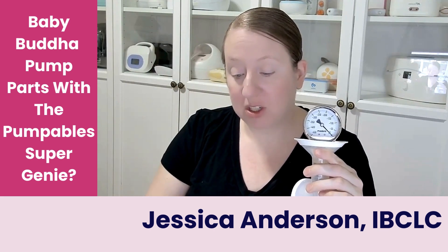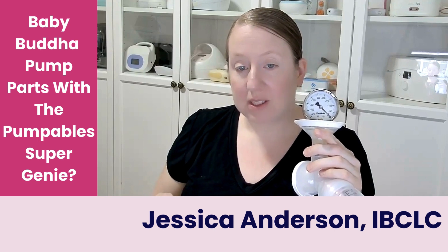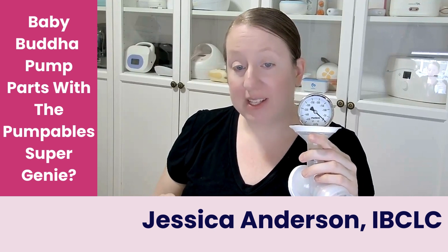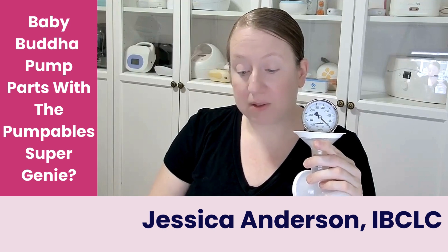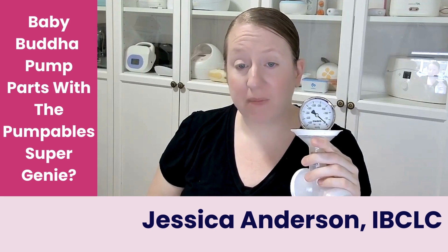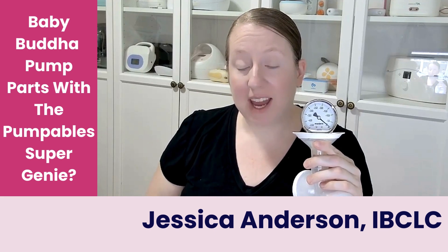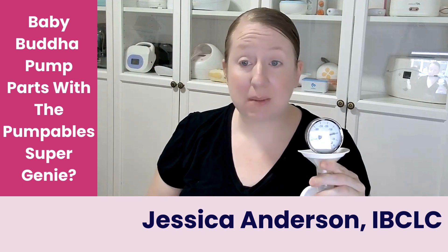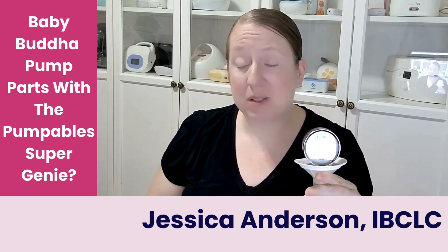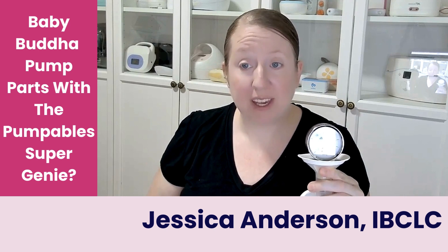That is definitely not equivalent suction. But let's switch over to expression. See the big pause in between pulls. Let me turn this all the way up — it starts on level five and it can go up to level 16. This pump is very customizable. We're topping out at 125 mmHg. This is supposed to be a hospital grade pump, which means we should be getting a minimum of 250 mmHg at top suction.